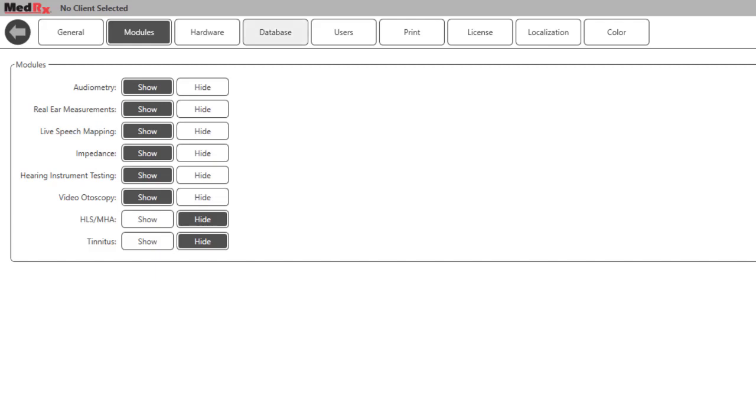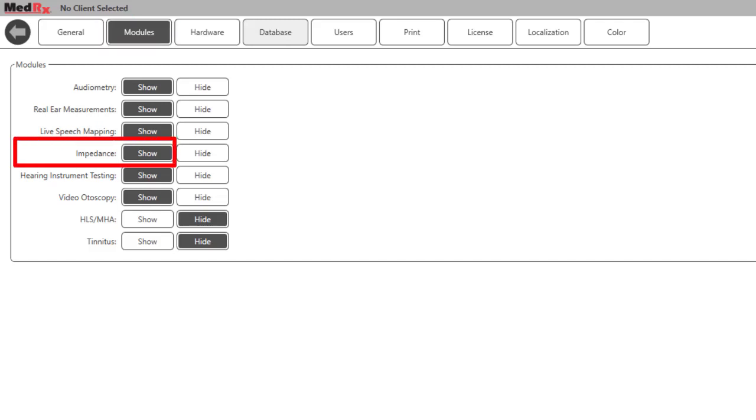If you do not see the impedance icon on the main screen, use the modules tab to make sure that the impedance tab is set to show.